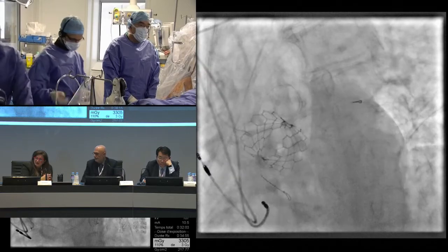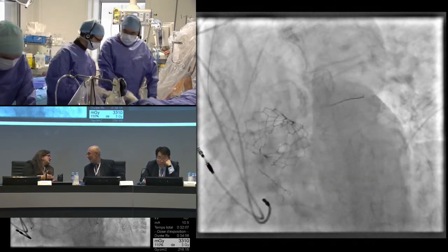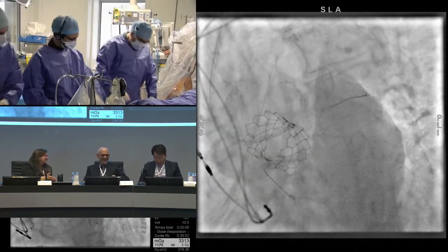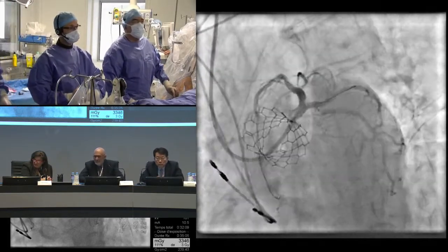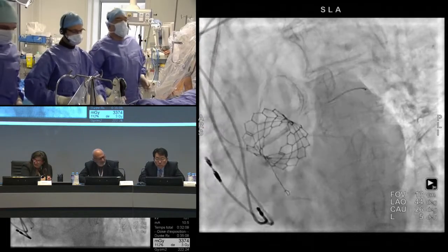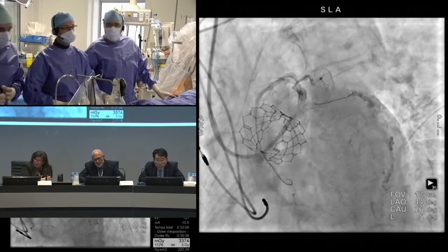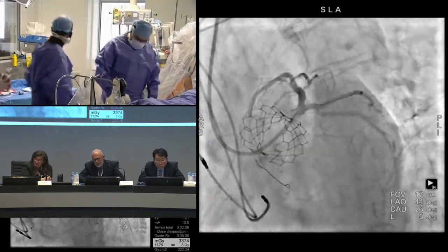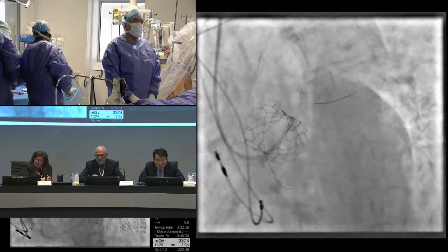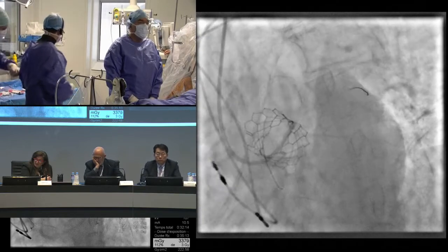Just because you're not using IVUS. We can do IVUS. Come back if you want with a 3.5 millimeter stent. Yeah, LAD. Pressure. Donnez-moi un 3.5 par... It's a good test. It's a good comment, Roxana. So what we can do, it's not too bad, eh? Look. And what we can do is to place a 3.5 millimeter stent. On a un 3.5 par 15, on en a un sur la table. That looks really good. And I agree, we will take 20 atmospheres with the LAD stent. LAD balloon. Okay. With the 3.5.